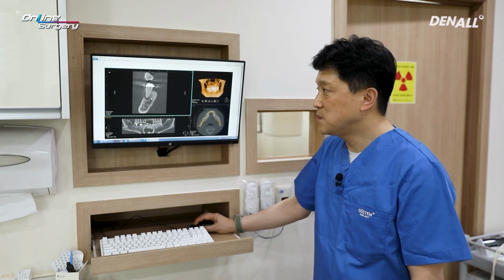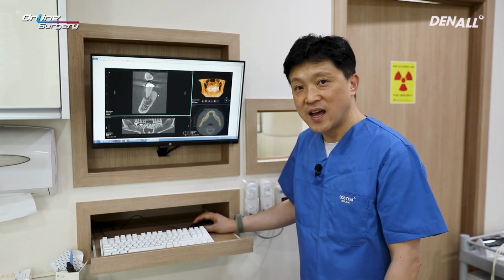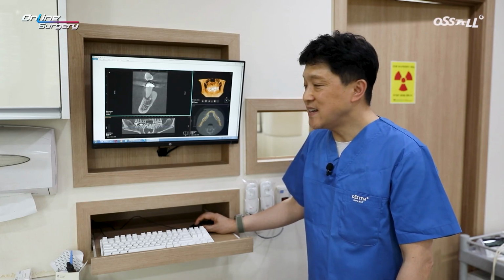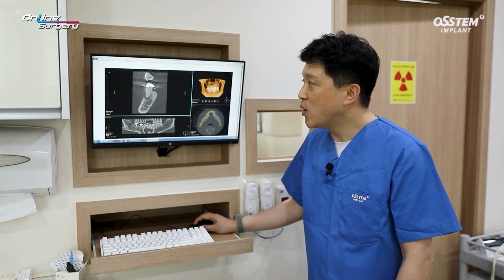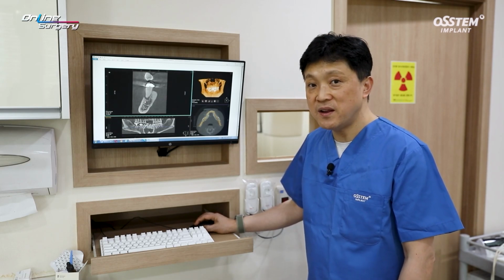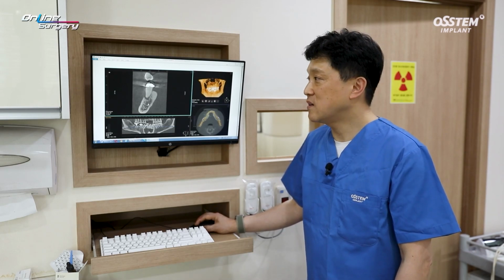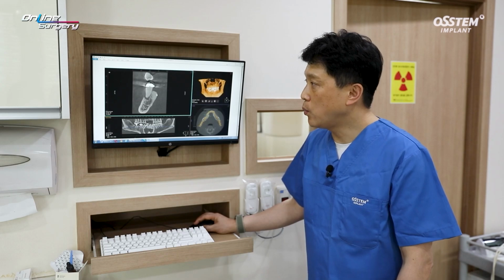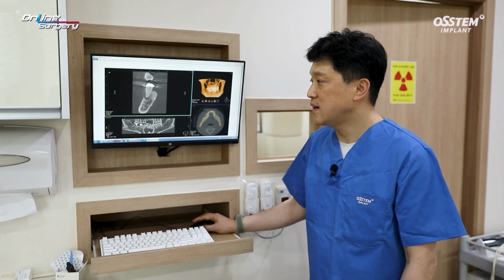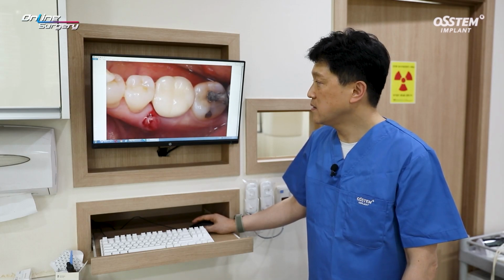When we look at this kind of CT, the precaution we need to take is that, as shown on the lingual side, the cortical bone is very hard. Because of that, when drilling is performed, it is very difficult to drill towards the lingual side, and there is high possibility that the drill will be deviated towards the buccal side because there's less resistance there. We need to think of this ahead. There's difference between knowing about it and not knowing about it. This can be a bit of a pickle.